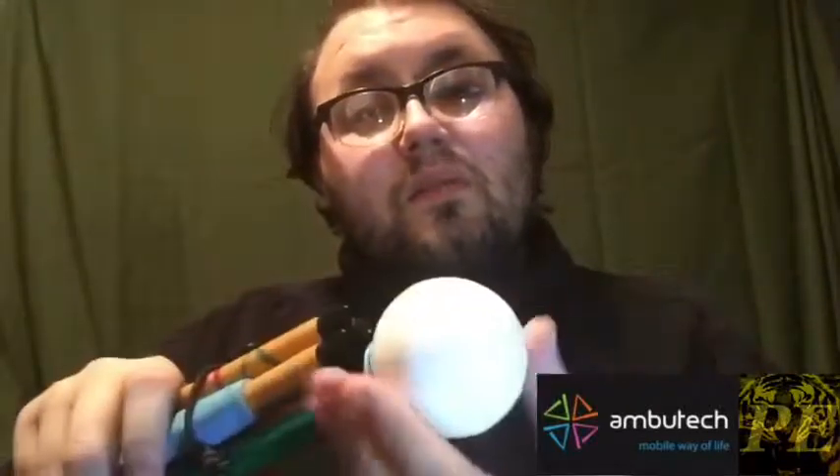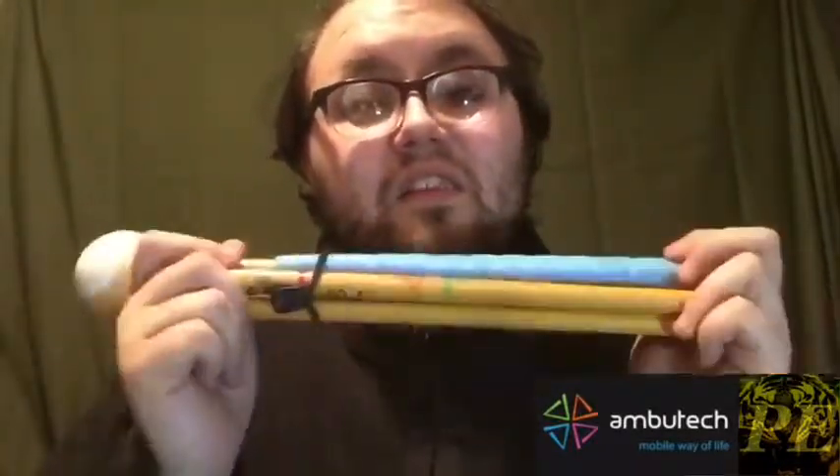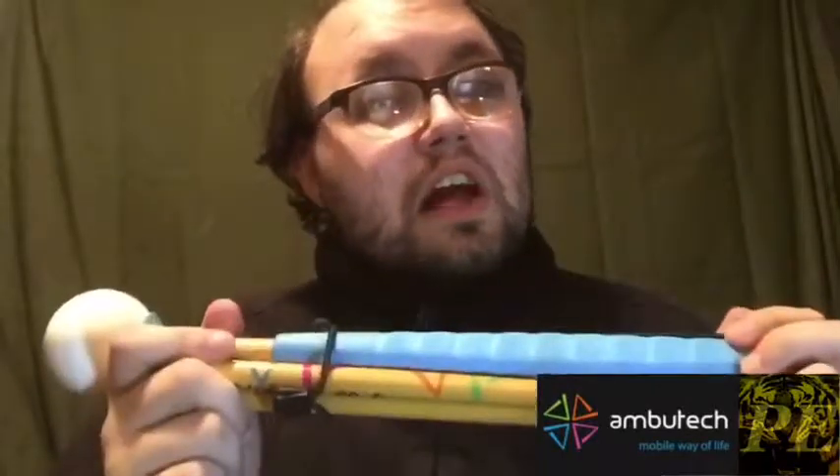The custom cane also has a roller tip on the bottom instead of a pencil tip. With a pencil tip you tap; with a roller you glide. It depends on the mobility technique or preference of the user. You can choose different tips with all types of canes. This custom cane is for cosmetics, matching with clothes for fashion, or use with friends in a safe environment — not as your primary mobility device.